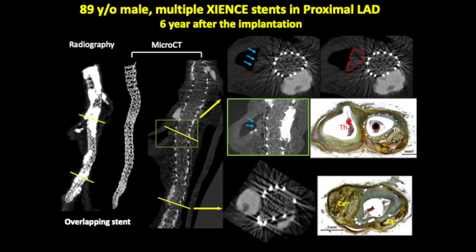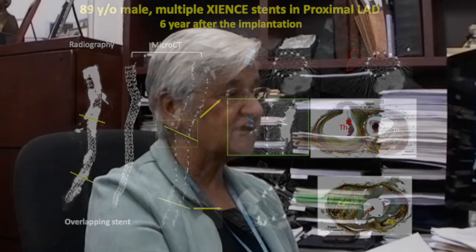By microCT, an 89-year-old male with multiple stents in the proximal left anterior descending six years after implantation. This shows the area of the bifurcation — you can see the stent and the calcium. The microCT longitudinal cut clearly shows the calcium, and at the bifurcation site you can see the stent cross-section. Thrombus is visible on the luminal side, confirmed by corresponding histology.